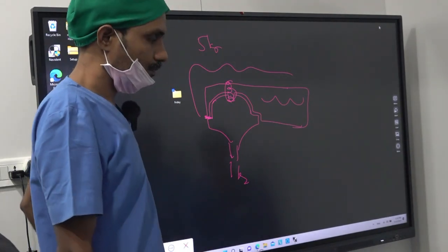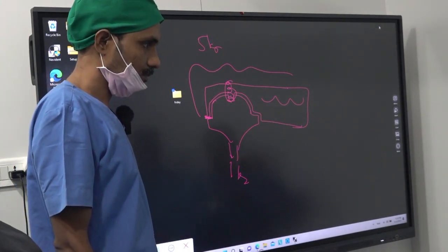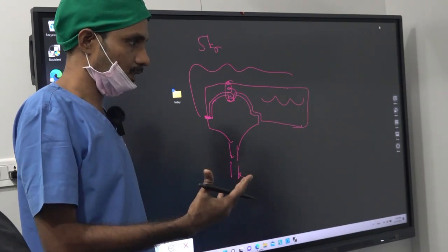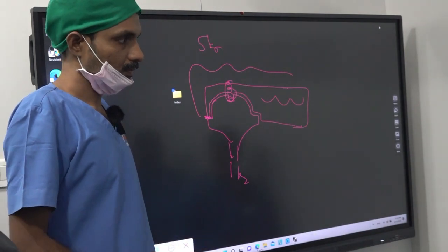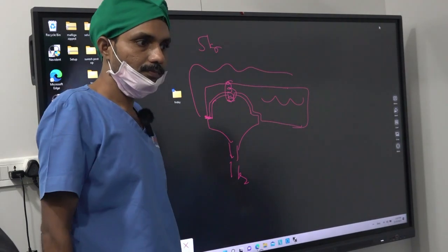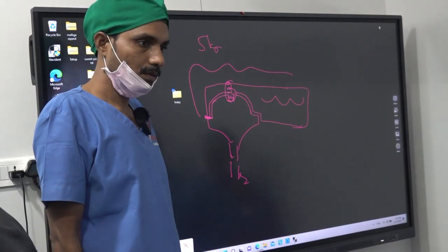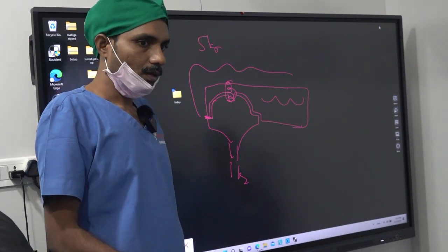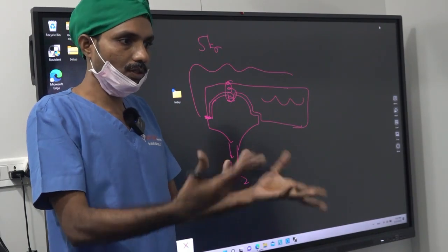So if the final process is going to be heavier, because the multi-unit attachment and bar attached it will be more heavy. No, the titanium bar is very much weightless. It is 1/3 of the regular metal. Very much weightless. And the thing is, the welding wire would come. So the process is on top of it. Below that it will cover the welding wire. Sir, or you can expose the welding wire also. That doesn't matter because it is on the lingual subpalatal side.